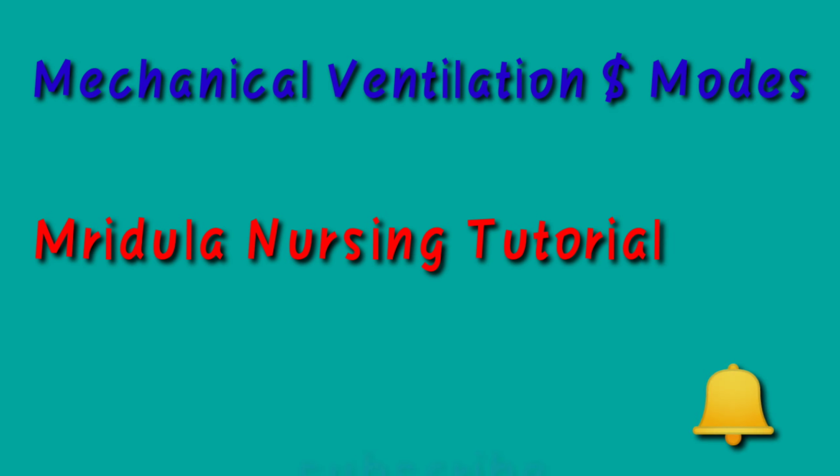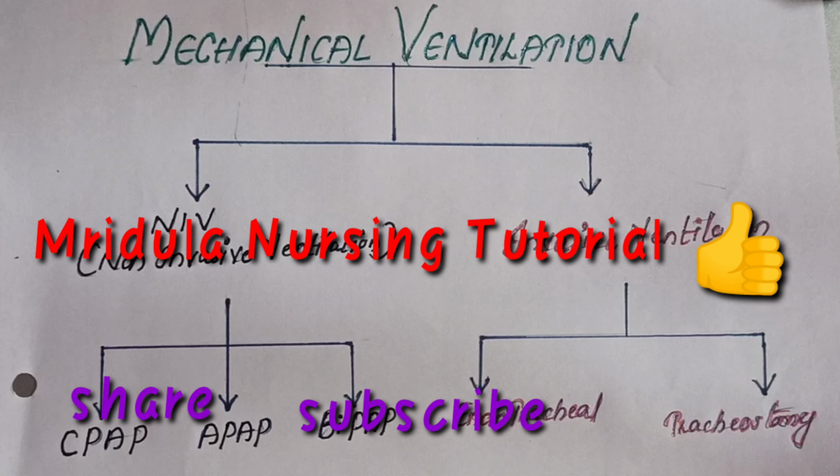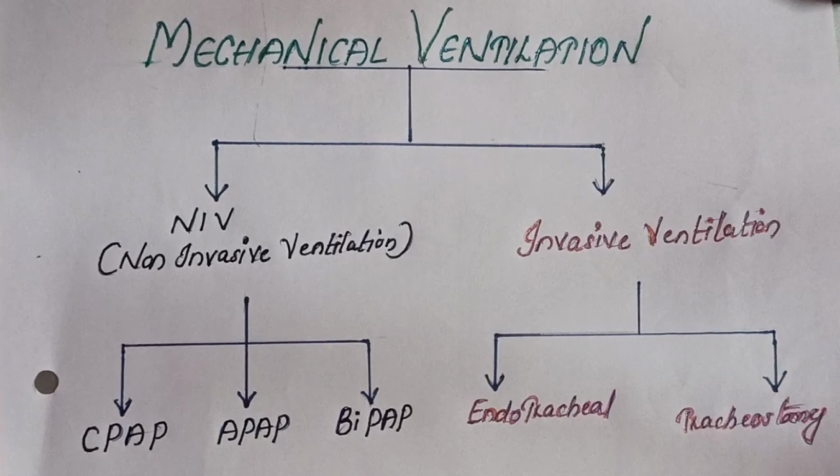Hello, today we will see what is mechanical ventilation and its modes. Mechanical ventilation is a treatment to help a person breathe. A ventilator is a machine which pushes airflow into the patient's lungs to help them breathe.